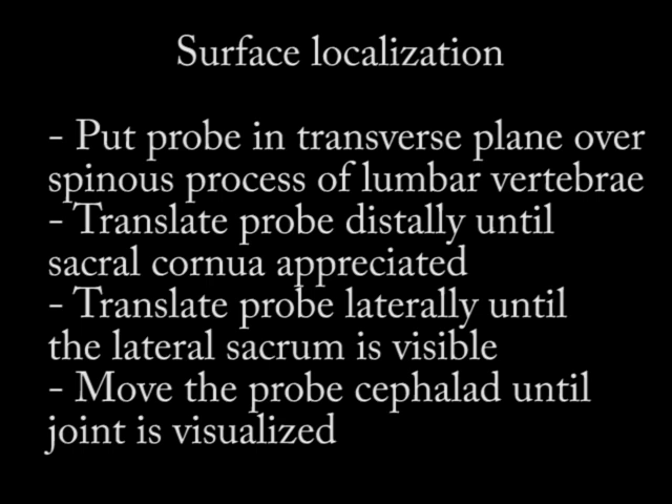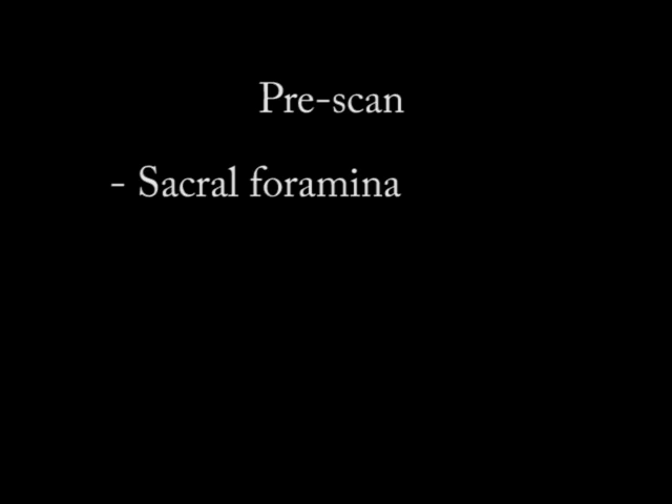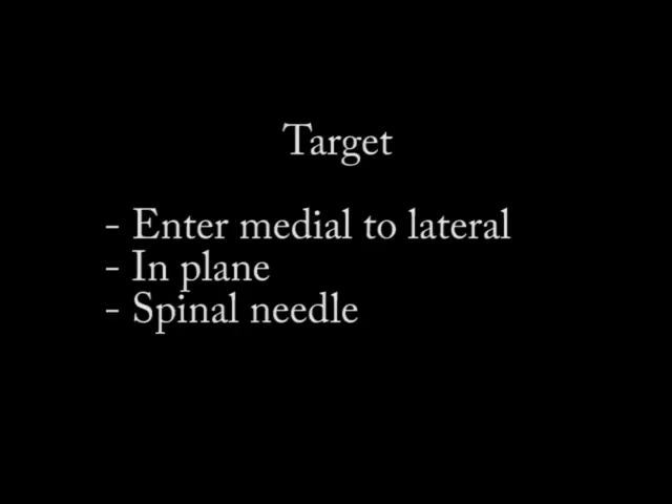On my pre-scan, I want to identify the sacral foramina because I want to avoid these when I inject — they can look very similar to the SI joint if you're not careful. Once I've identified my target, the SI joint, I'm typically bringing my needle in from medial to lateral, in-plane. Because of the depth of the SI joint, I'm going to need to use a spinal needle.